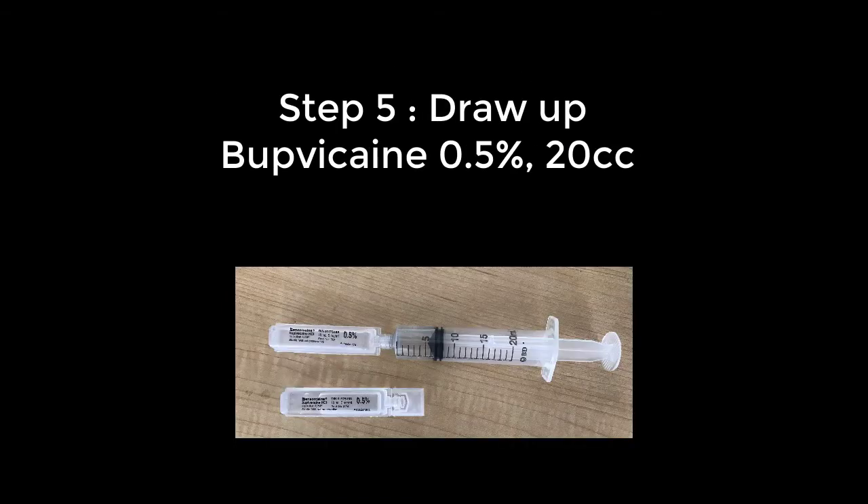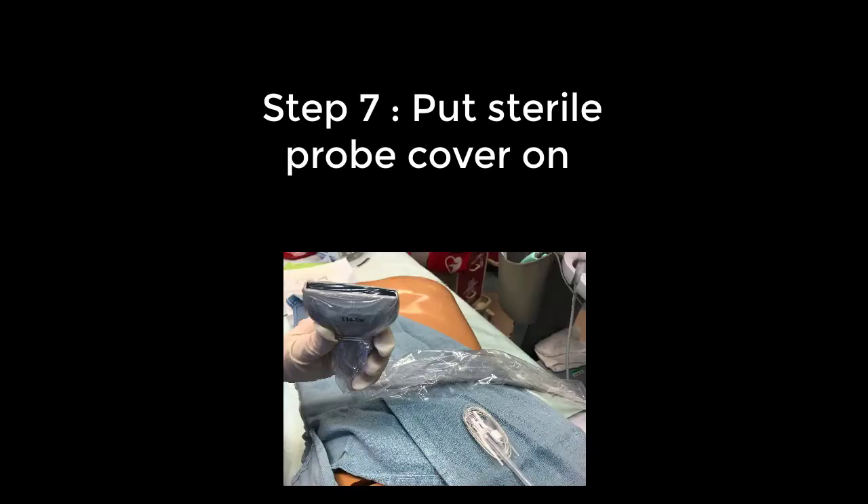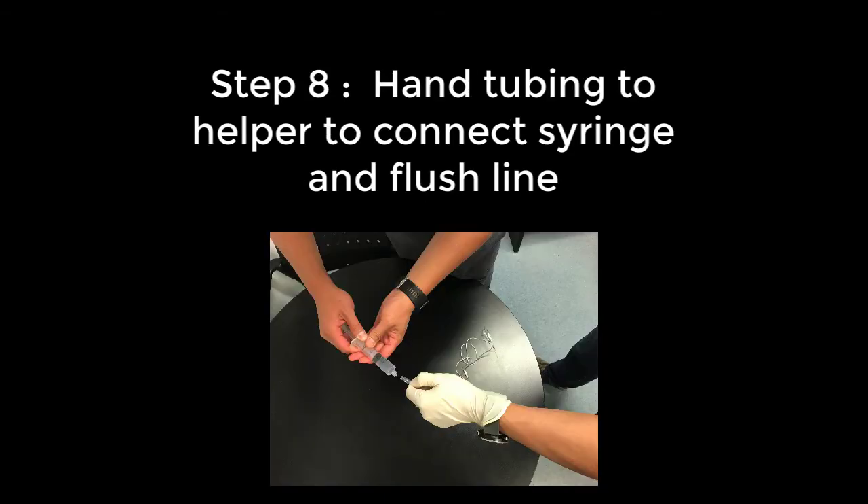Draw up the 20 cc's of 0.5% bupivacaine and hand this to the helper. Now put on your sterile gloves. Be sure that there is ultrasound gel on the transducer face and then apply the sterile probe cover. Hand the tubing to your helper to attach the syringe and have your helper flush the line.